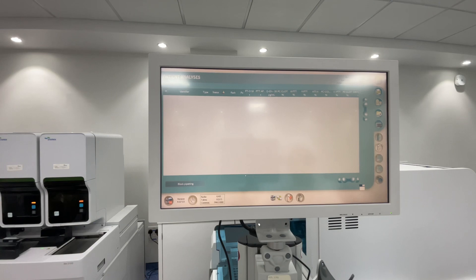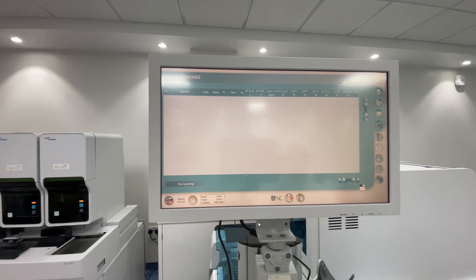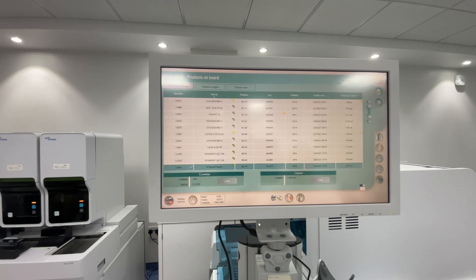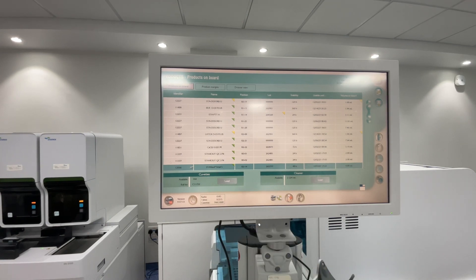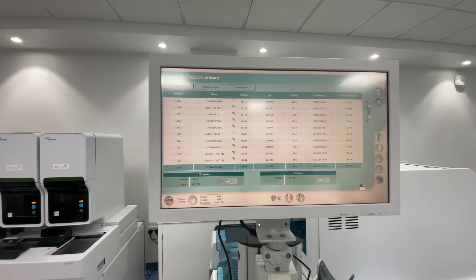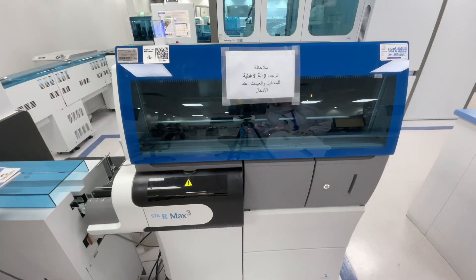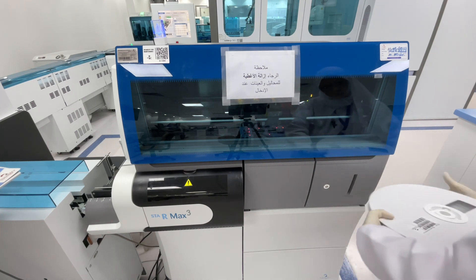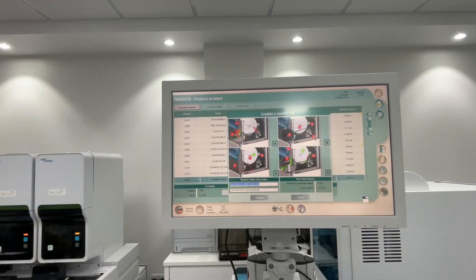To check your reagents and disposables - these are your rack tubes and cuvettes. You can check here for your products, load cuvettes, and load your cleaner. You still have 744. To load new cuvettes, click Load, then read the barcode from here, then click Validate.